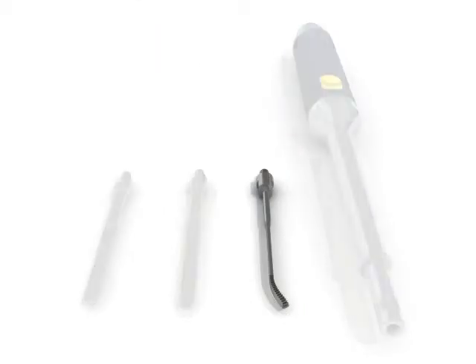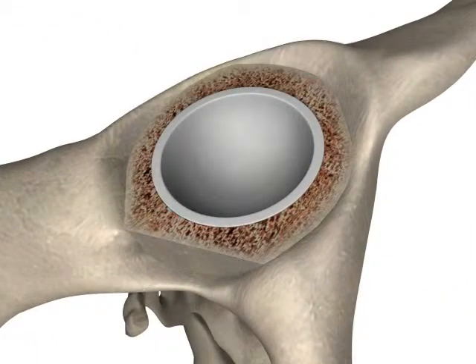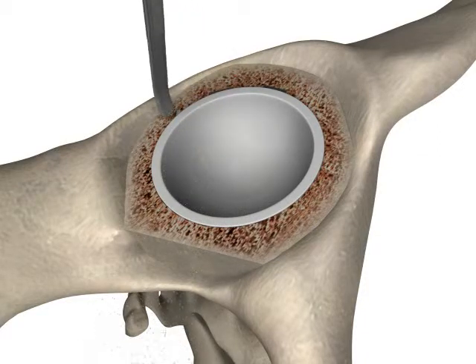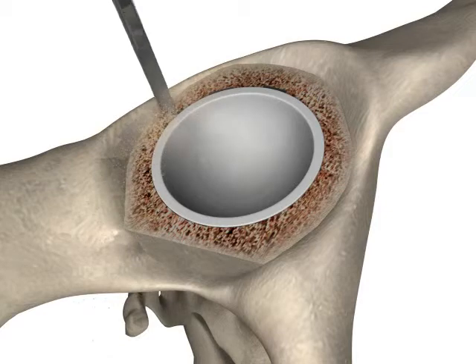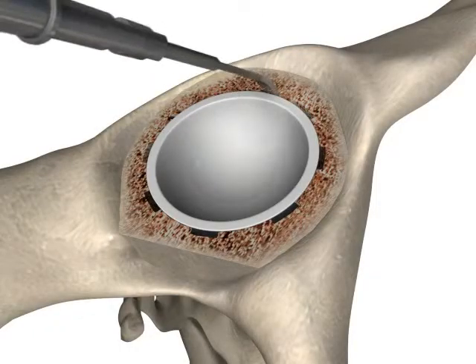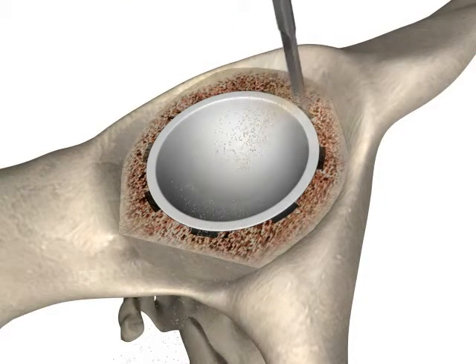The curved bone cutting acetabular probe is used in a similar fashion as the cemented version. The probe is first used to create slots around the circumference of the cup. Once the slots are created, the probe can be used in a lateral motion to cut the remaining bony ingrowth interface.